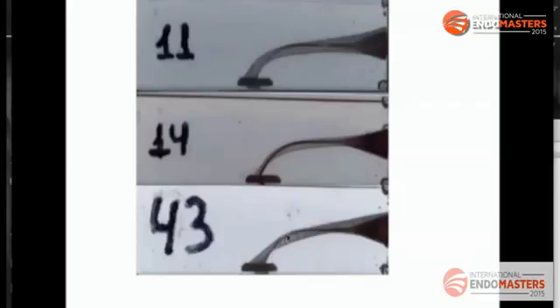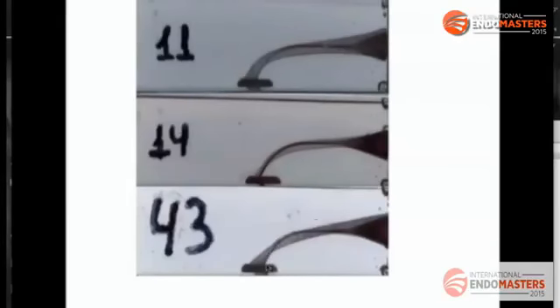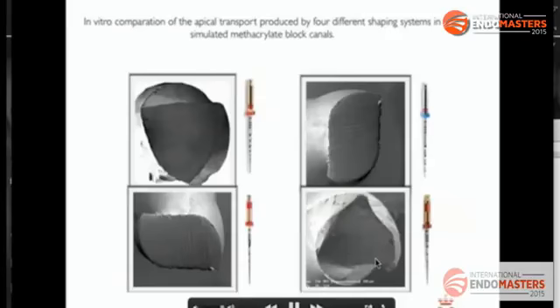This is important because the big difference between the systems is this: with any system on the market, we can shape the root canal perfectly and do a good treatment. But some systems are easy to use, and it's difficult to create a ledge or a transportation, and with other systems you can work perfectly, but they are more difficult to work with, so we have to take care not to make any transportation or ledges in the canal wall.